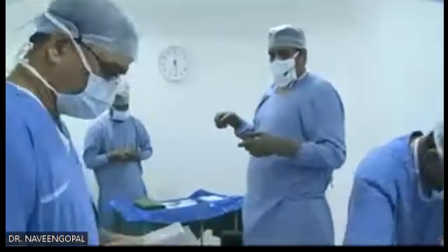So now we are going to load the lens. There will be a drape here.